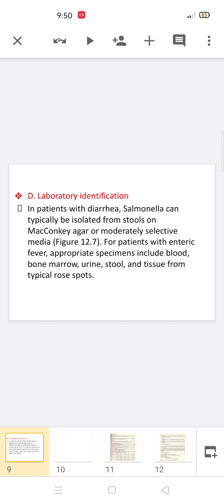We take the serum of the patient and serially dilute this serum in test tubes, and then apply it on separate test tubes for O antigen and H antigen and observe the clumping, agglutination or turbidity in the test tube or on the glass slide.